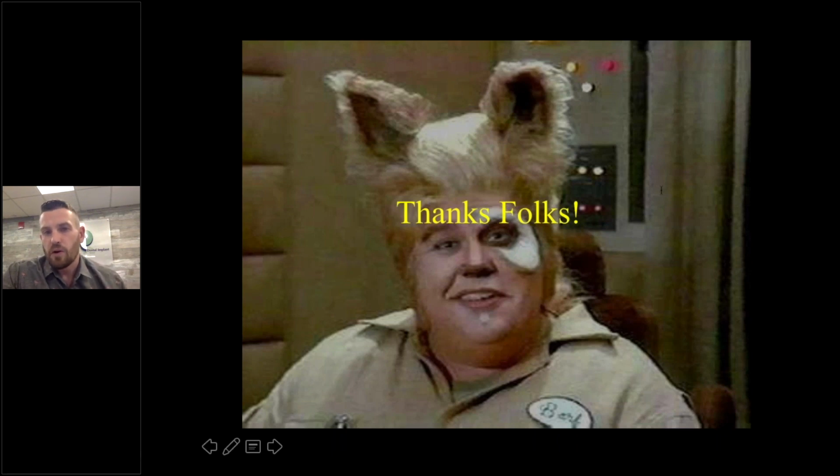Another question from John. Case number 4, two separate membranes or one across and over the submerged implant? So case number 4, two again, so two and then a PRF membrane over the top.